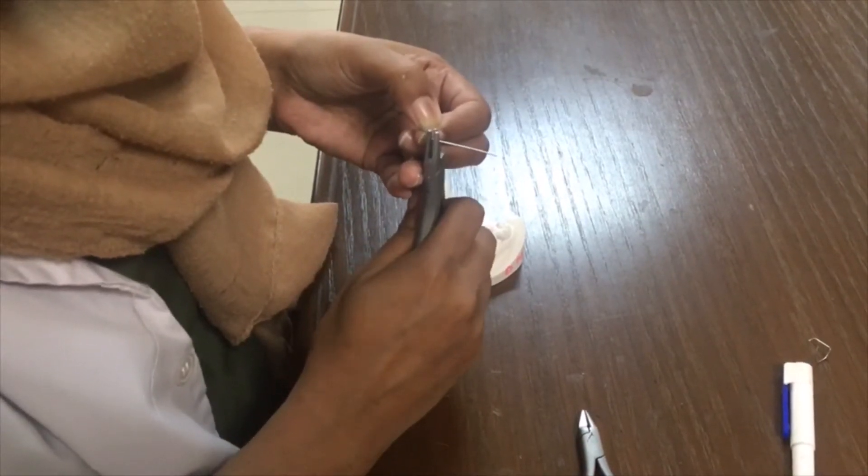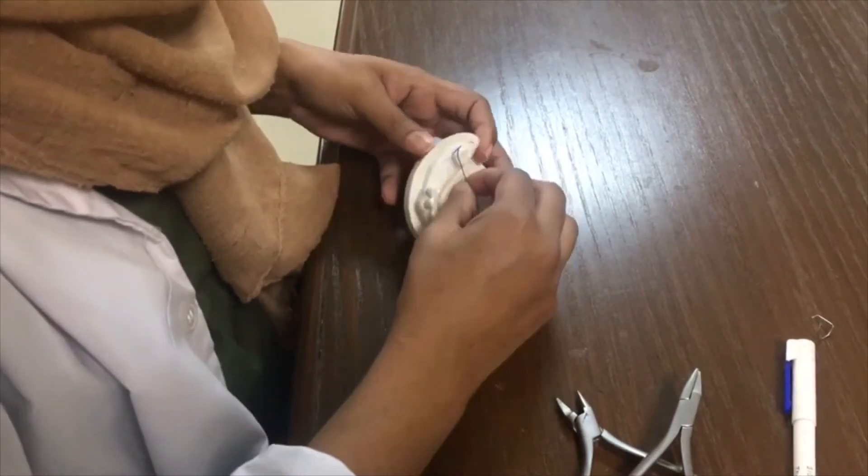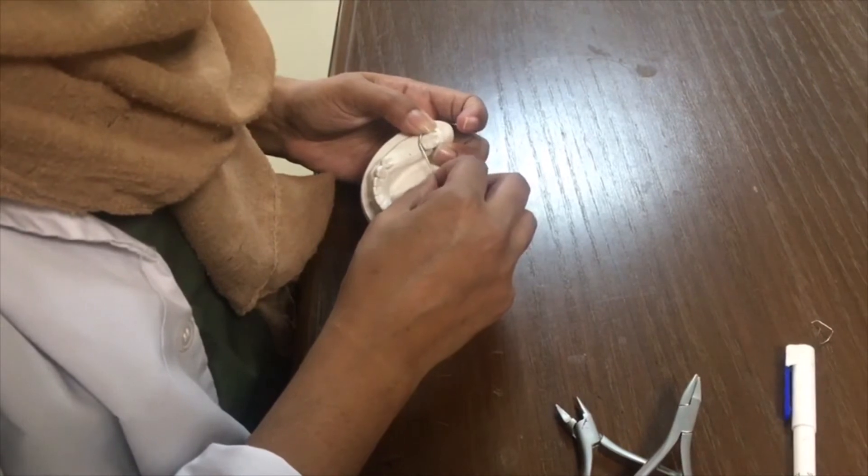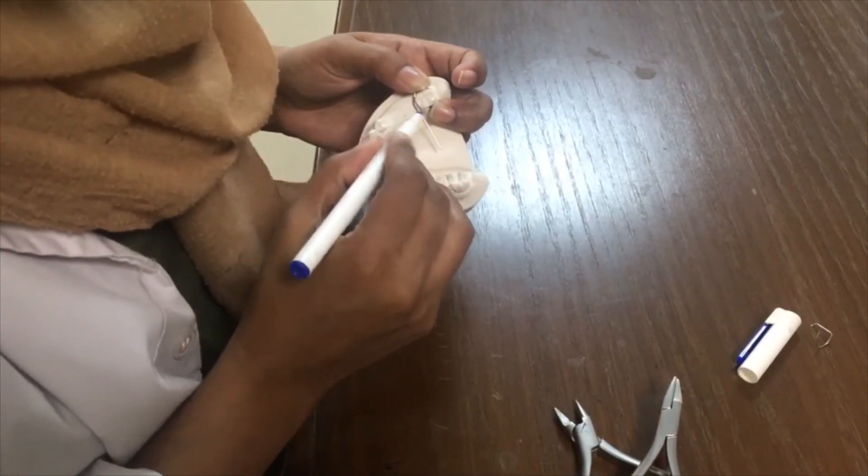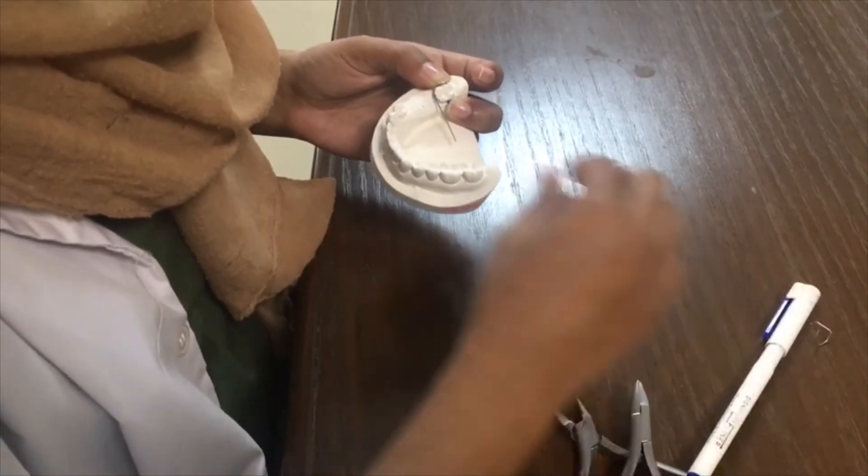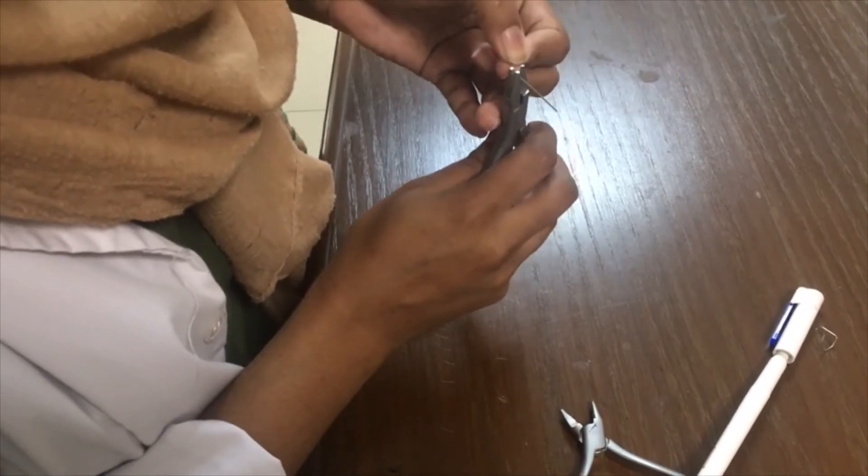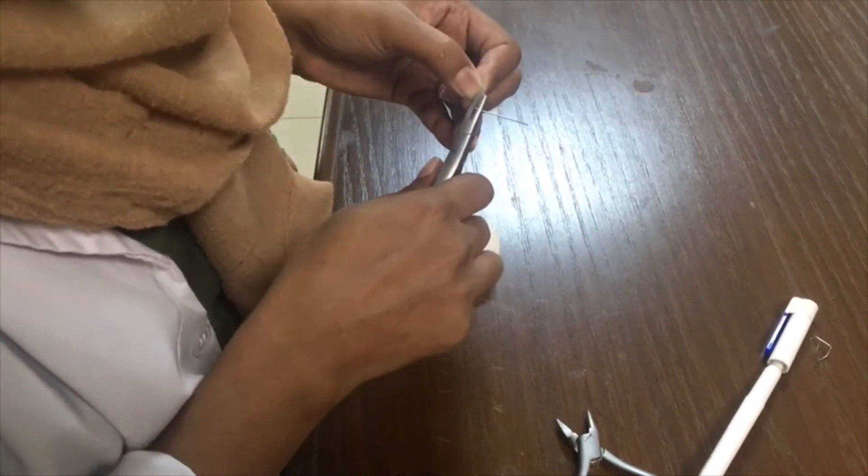So let's start the construction of the clasp. Now you see that basically you have to place the wire on the surface of the tooth starting from the buccal surface, place the end of your wire on the mark on the buccal surface and start adapting it all along the circumference of the tooth. So you have to bend your wire in the same way that you bend your wire when you are making your alphabets.